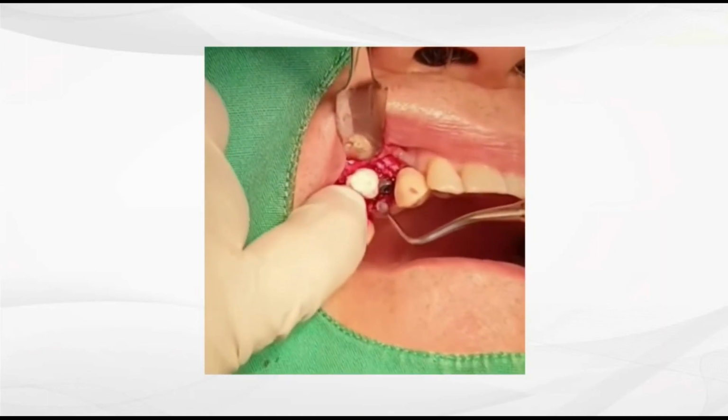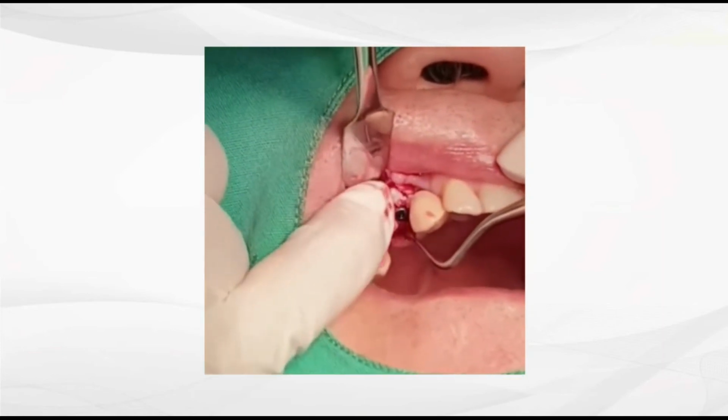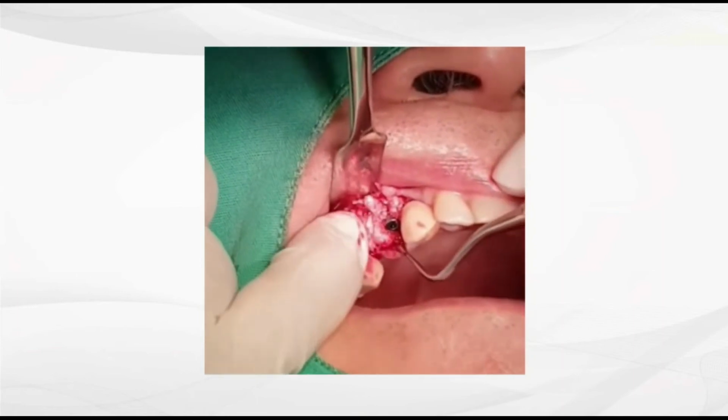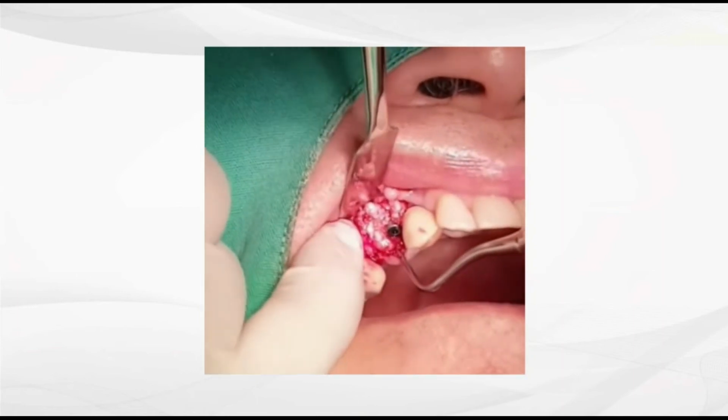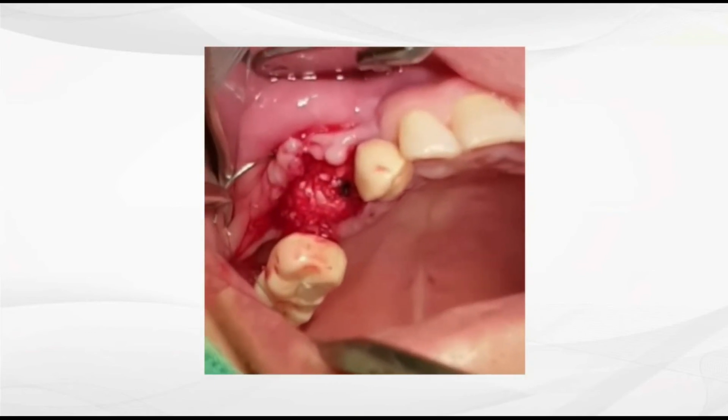Since type 1 collagen is the main component of AutoBT, which acts as a sponge that attracts blood, be sure to check the blood absorption as shown in the video and do the usual watertight suture.